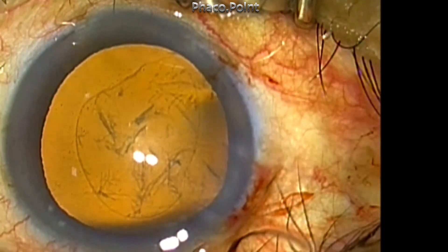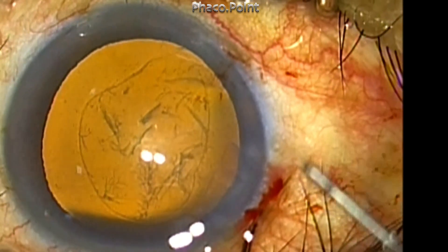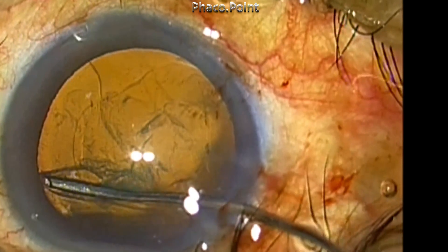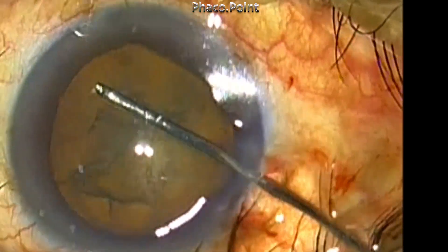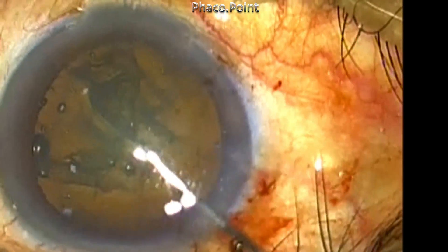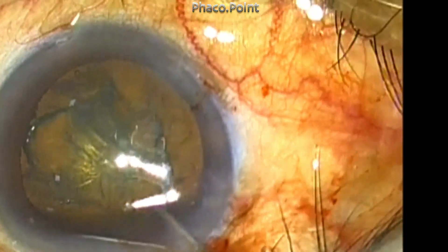The capsulorhexis is completed, though it's slightly eccentric. Now first I'm going to perform the cortical cleavage hydro dissection. The cannula is passed underneath the capsulorhexis edge, gently lifted up, and a gentle but firm pressure of fluid is injected.